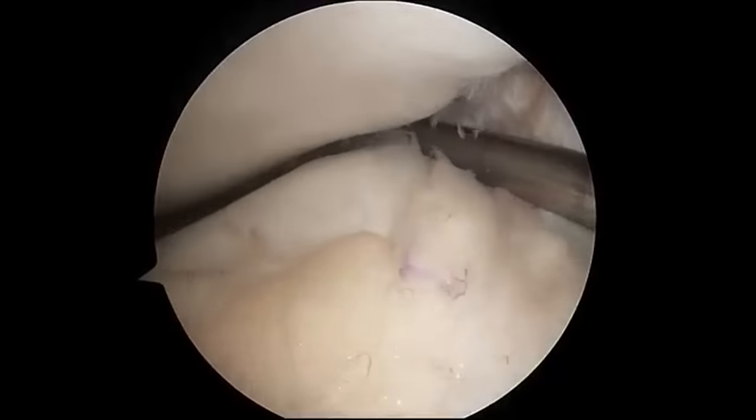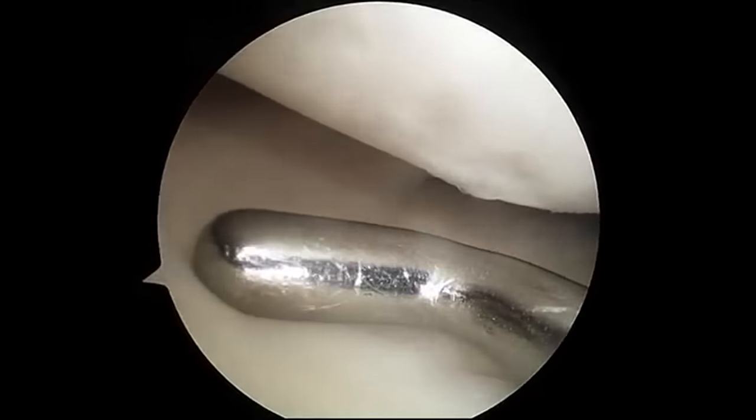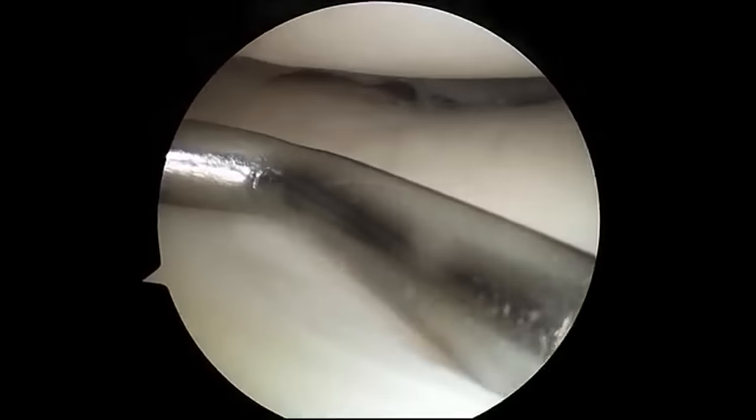On the other side of your knee is your other meniscus cushion right here. This cushion looks pretty good. You have a little bit of arthritis on this section of your knee.